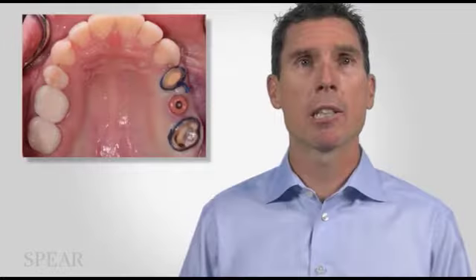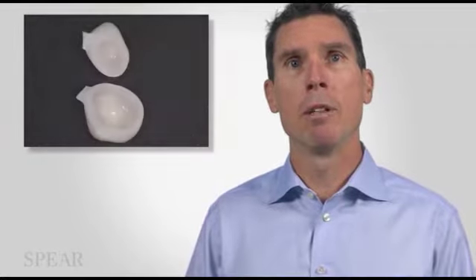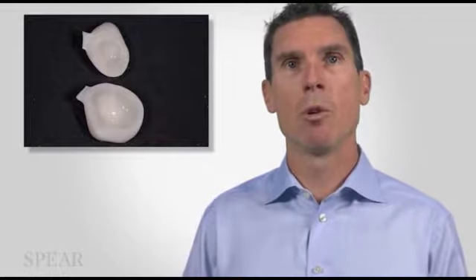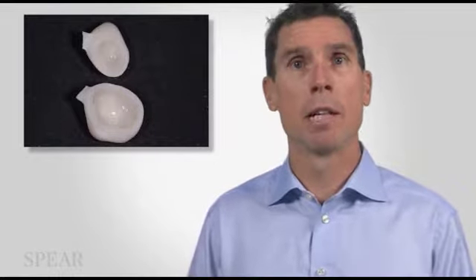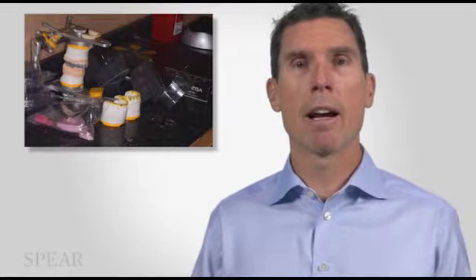And then on that same day, actually, I went and I prepared the upper left. I had some time. And then I scanned and milled the provisionals. Now, I'm going to go into detail in a minute just so I don't confuse you on how I scanned the upper teeth. But for right now, just know that I scanned those and put some provisionals in on this day and left the implant as it was. So that was the end of day one, actually, because we ran out of time.